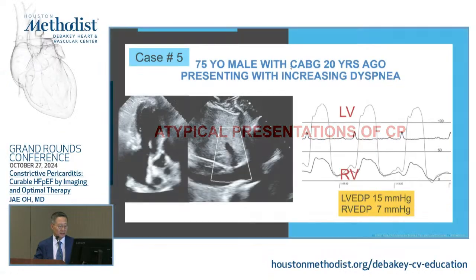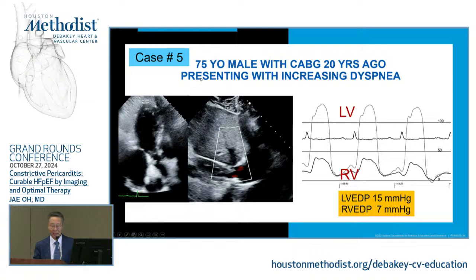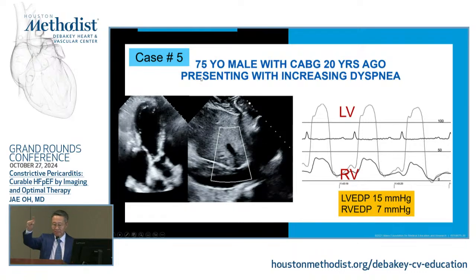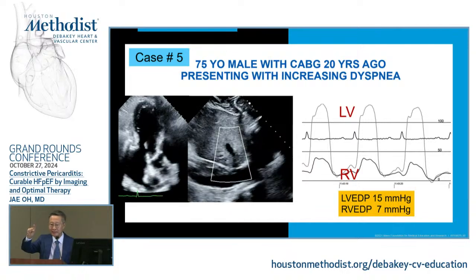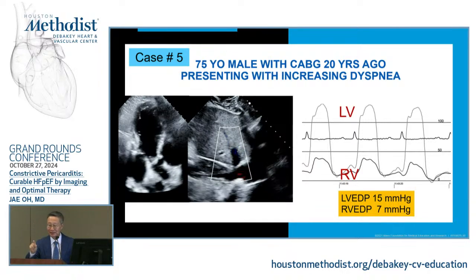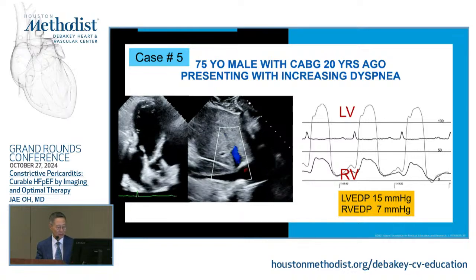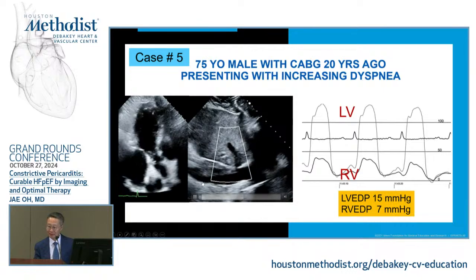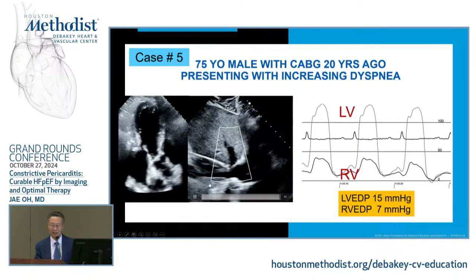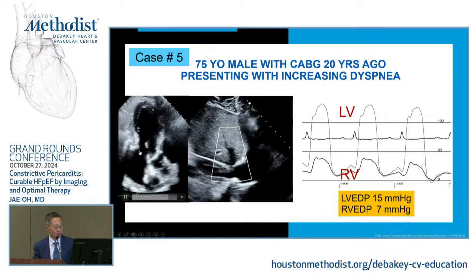Here is a 75-year-old patient. I told you that the initial box was the IVC plethora. I think we made a mistake, because we are seeing many patients, not many, but a substantial portion of patients with constriction looking like this. I mean, this is a huge respiratory collapse. People say this cannot be constriction, right? High filling pressures. But this one is a little distorted here.